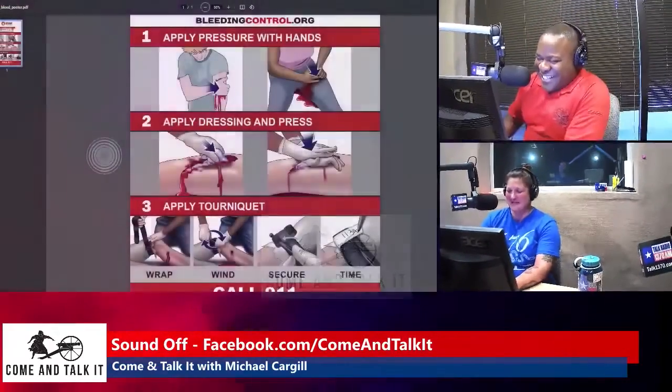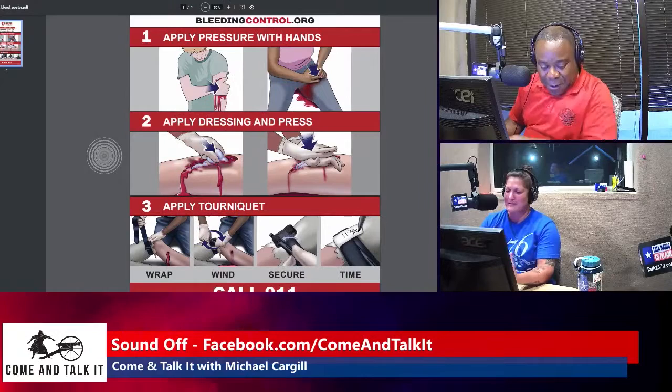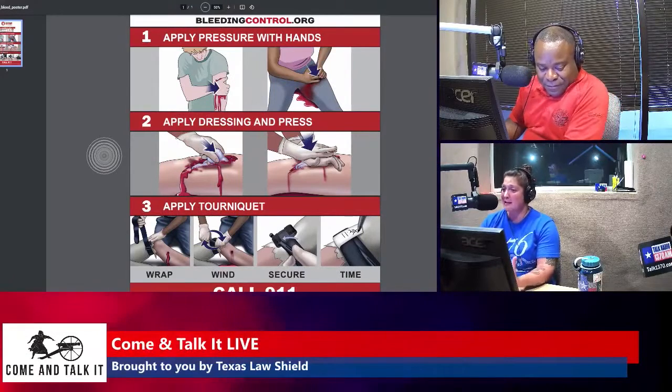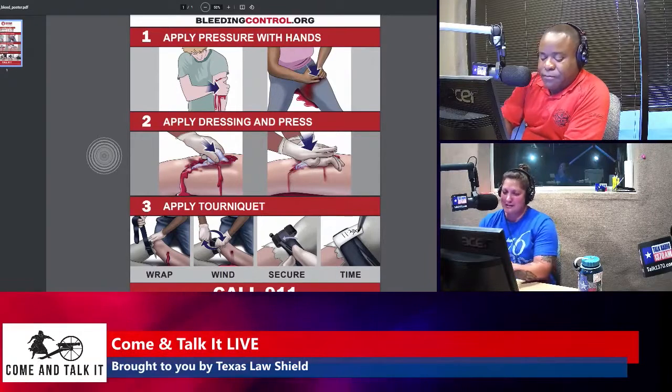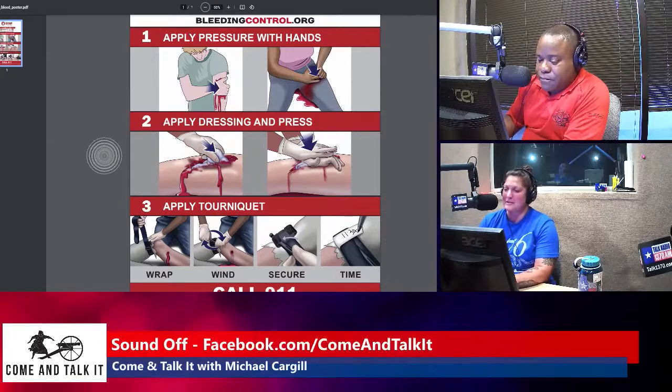So, you mean to tell me that I'm gonna provide my body as a specimen, and I'll stab myself and then allow my customers to come over and save my life. Yes, absolutely. I mean, that adds to the realism. So for tourniquets, I like them to put them on themselves so they can see that they're not comfortable. It hurts, it pinches, and we're going to walk through how to not hurt each other necessarily in the class because there are some issues with that.